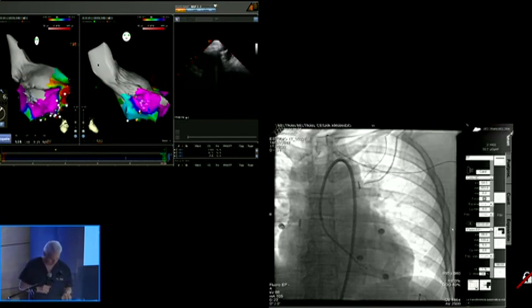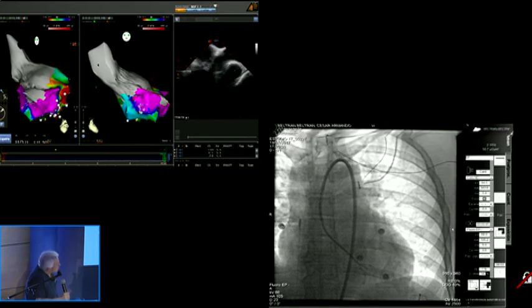All right. Well, he needs to stop moving. Show me left. Can you see the recording on the Pruka now?